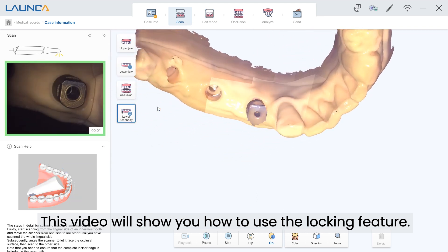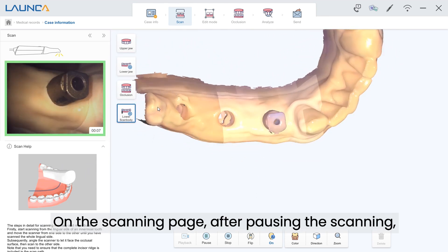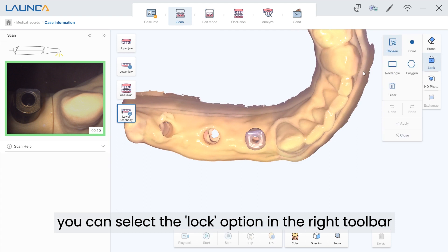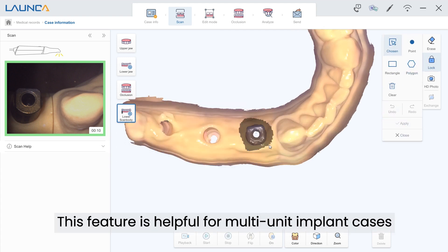This video will show you how to use the locking feature on the scanning page. After pausing the scanning, you can select the lock option in the right toolbar to freeze the scanning area. This feature is helpful for multi-unit implant cases as well as preparation scans.